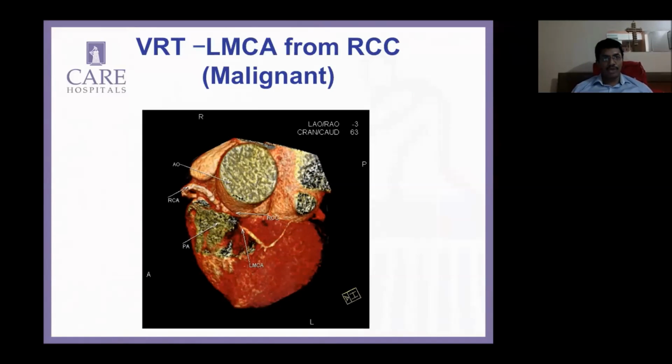The patient came over 2 days later. I just wanted to make sure that she was well set. And 8 seconds later, we get this unbelievably good picture. I'm just going to go through it for the rest of the people not used to it. These are posterior structures. That will be the left atrium and the pulmonary veins. That's the aorta for you. I've labeled it. And that's the pulmonary artery snaking in between. You have the right coronary sinus, with the right coronary. You all saw that very nice, large right coronary.